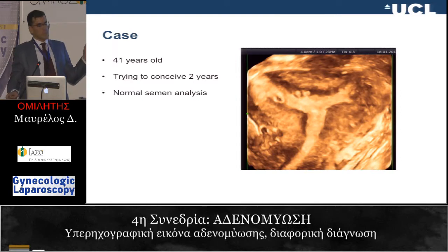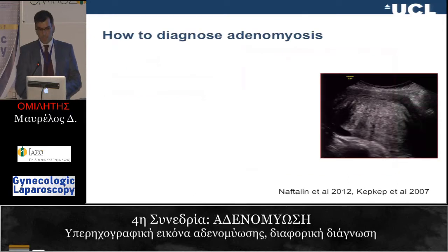This is the coronal plane of her uterus, and you can clearly see that there is a myometrial cyst just here. Excellent. So here's a myometrial cyst, and you can see that the myometrial-endometrial junction is disrupted, and there's this blebbing, this growth of the endometrium into the myometrium, and this is a case of adenomyosis. So this is my topic: how to diagnose adenomyosis.